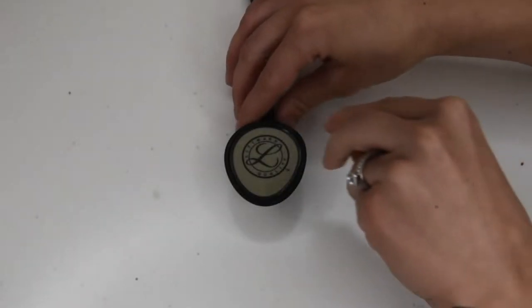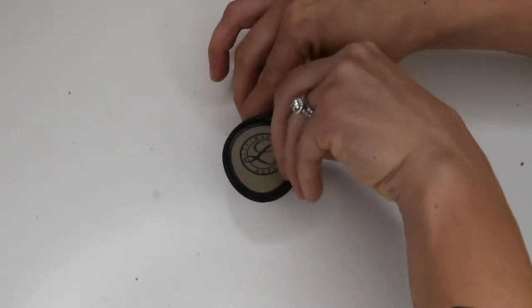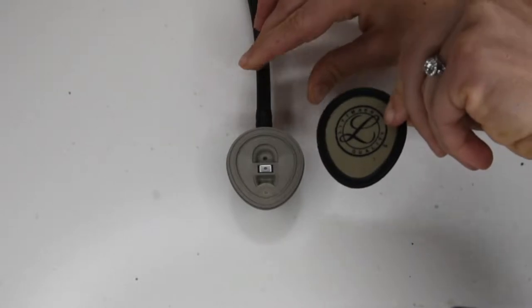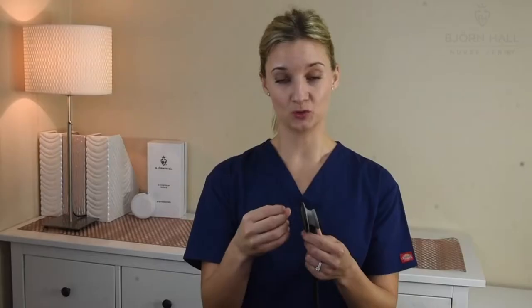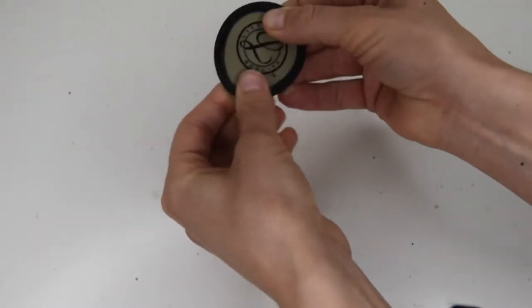So to actually remove the diaphragm off the stethoscope, you would simply put your fingers on the plastic rim of the diaphragm and gently pull upwards. It is quite easy to take it off. The plastic is really soft. It is one of the easiest ones that I've tried. If you're looking to buy one of these stethoscopes, you can head on to my YouTube channel and check out my full review of the Litman Lightweight 2SE.